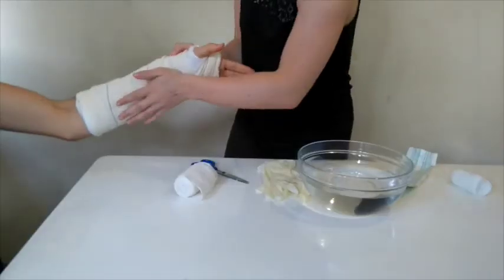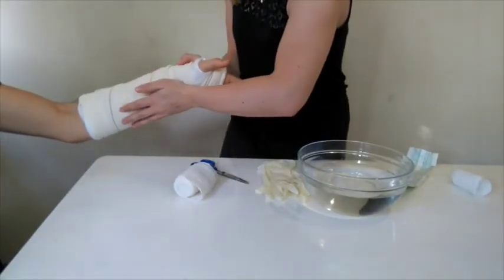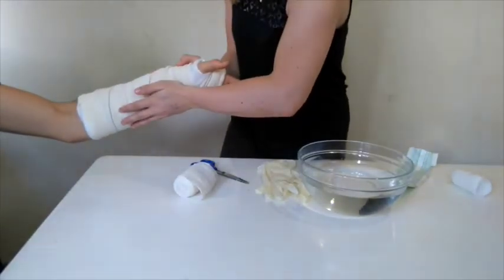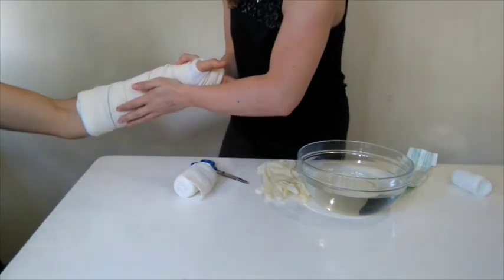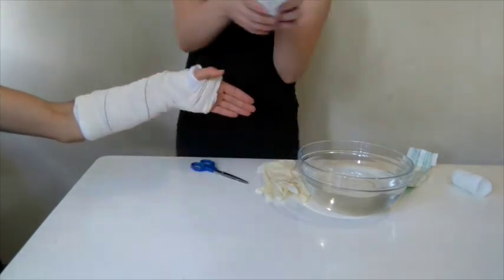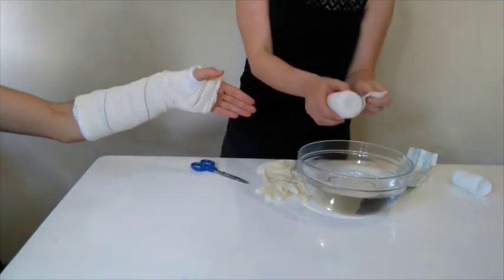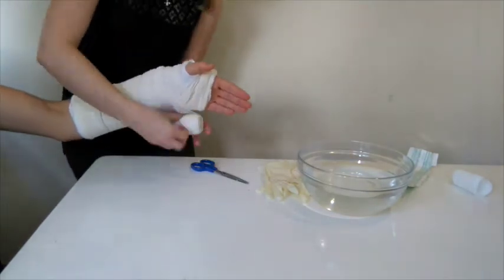It is important to hold this position for three to five minutes until the plaster of Paris has set. However, the plaster of Paris will only be fully set in 24 hours. Apply the third layer of plaster of Paris and mould it in the same way as before.